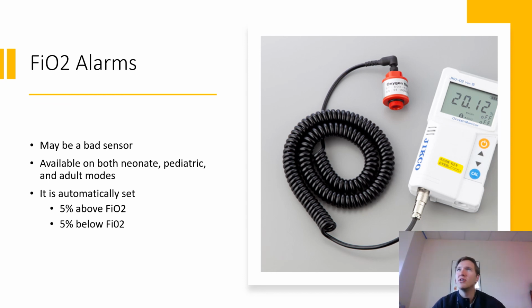And then also make sure you understand, how am I going to approach it? Do I start at the patient and work my way back, or do I start at the machine and work my way back? Do I just stare at the monitor the whole time, right? How do I approach these situations? So hopefully you got some good content out of it.